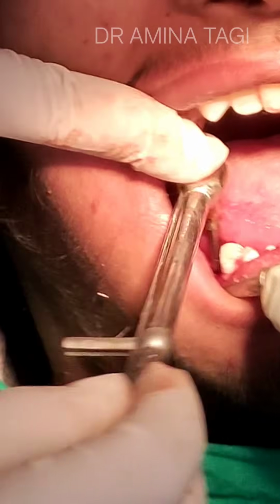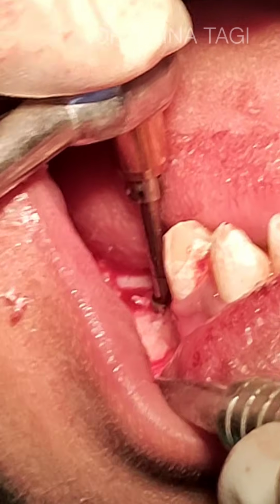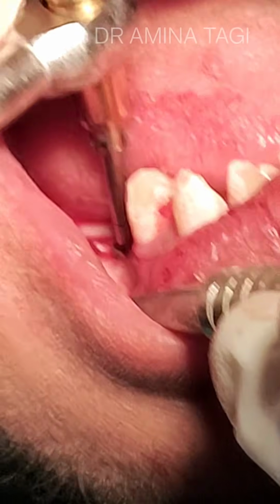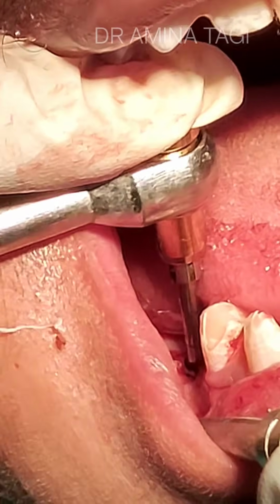When placing an implant with the hand ratchet, keep in mind to keep a very good apical pressure so that there will be decrease in the possibility of deviating the path of the implant. Also keep in mind not to apply too much pressure, as this will cause necrosis.